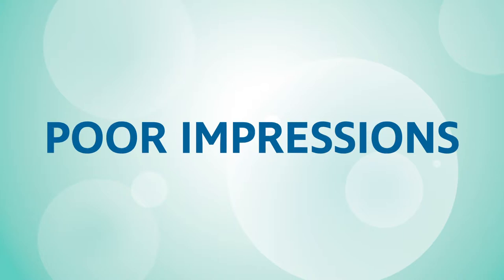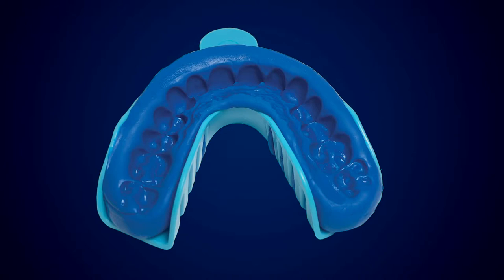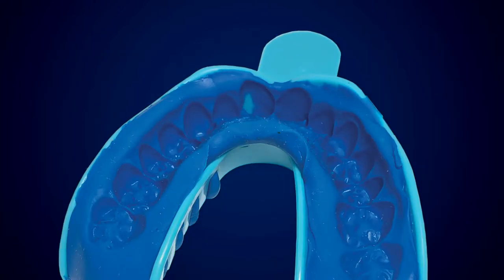Let's look at some common mistakes. Here, the putty didn't reach all the way to the back of the tray, resulting in the last molars not being properly captured. In this impression, the teeth were not completely captured as they were not pressed deep enough into the putty. This example is missing a solid gum line because the teeth were not pressed deep enough to be enveloped by the putty. In this attempt, the front teeth were placed too close to the front of the tray, resulting in the teeth scraping against the plastic.